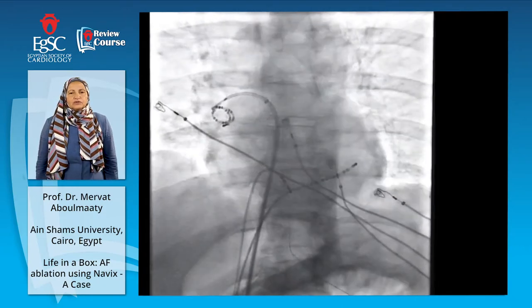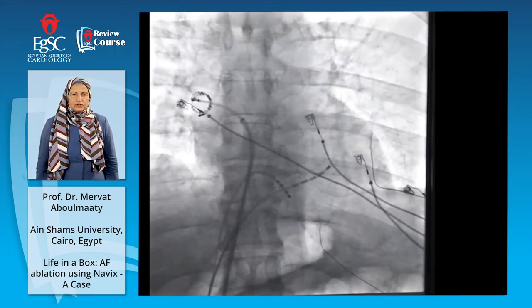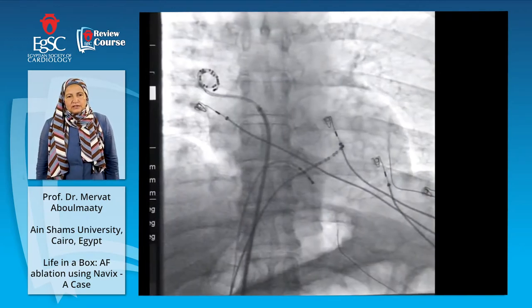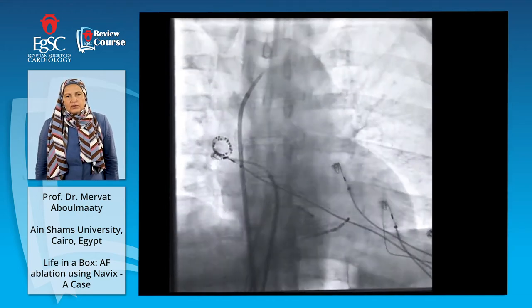Now we are going to the right side vein to park it, because we'll do another puncture to go into the left atrium. We have to do 2 transeptal punctures. We park it, yani, we put it in the right superior vein, and then we'll do another puncture. Now we'll explain this one.